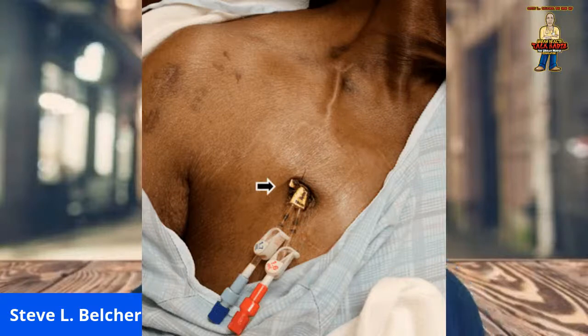How many warriors with a catheter know about what I just read? Knew about clots and how they affect your catheter. That's what we teach here at Urban Health Outreach Media. Did you know if the blood flow rate remains low for more than one dialysis treatment, the catheter should be checked and treated the same day?